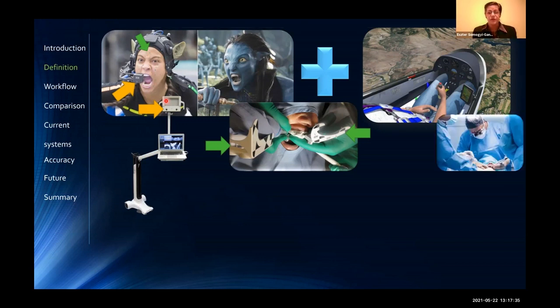It's also very useful if the surgeon has some computer skills, and I put flight simulators in here because it's very difficult in the beginning to start moving your hands not according to your eyes, but according to how it happens on the computer screen. Sometimes it's a little bit difficult to translate, from buccal to lingual, from up to down, because it's just a computer screen and an arrow that you're looking at.